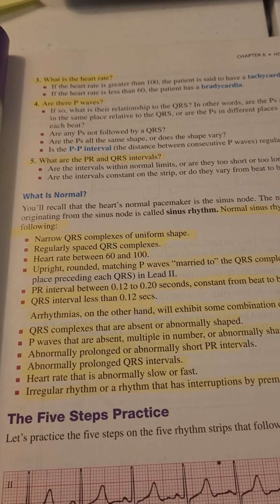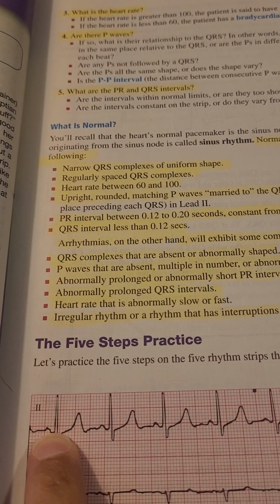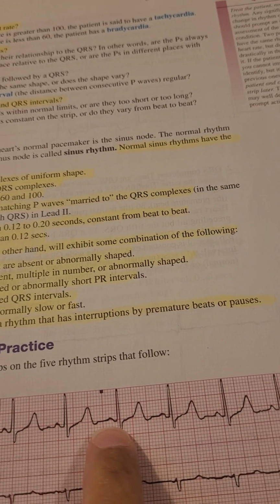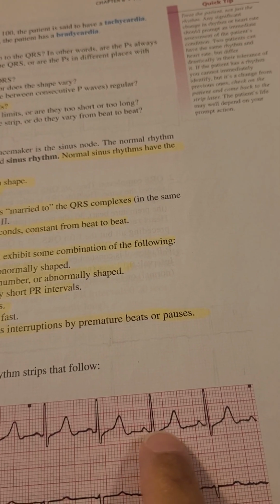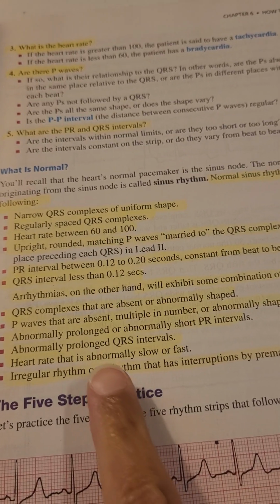Upright, rounded matching P waves married to the QRS complexes in the same place preceding each QRS. So there should be a P wave right before the QRS every time, and what they say married to them means the same place at all times. That's what a normal heart rhythm would be, the same shape and everything.